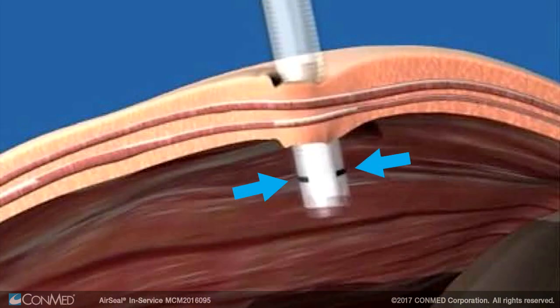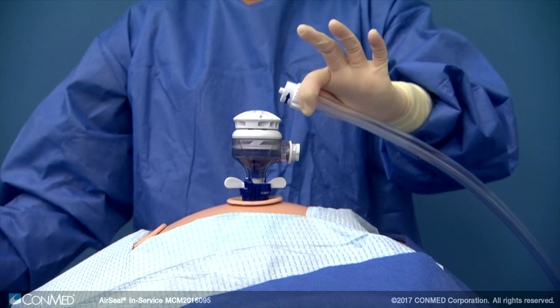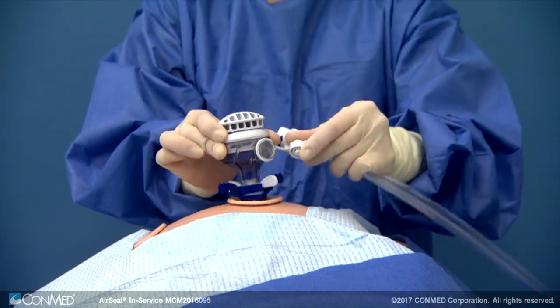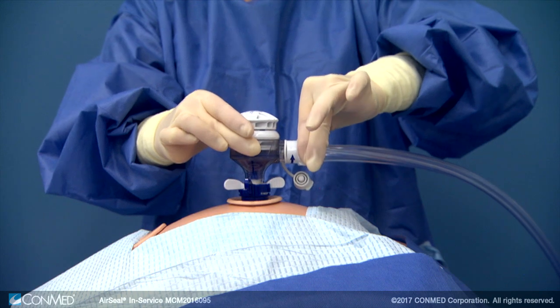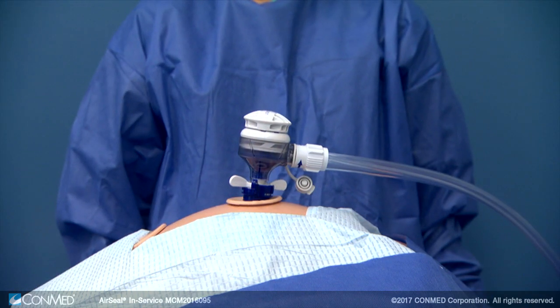Ensure the distal tip of the cannula is inserted beyond the black line on the cannula. Disconnect the single lumen adapter and set it aside. Remove the manifold plug from the bullseye manifold on the air seal access port. Connect the now exposed tri-lumen tubing connector to air seal's bullseye manifold by turning the tube set's locking ring clockwise until it's tight.